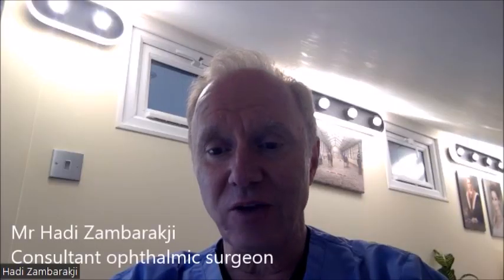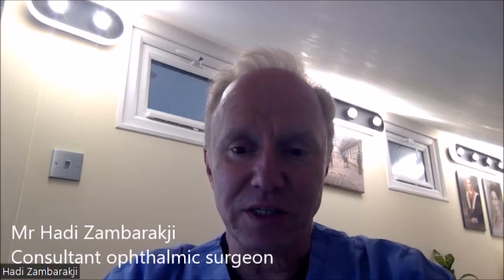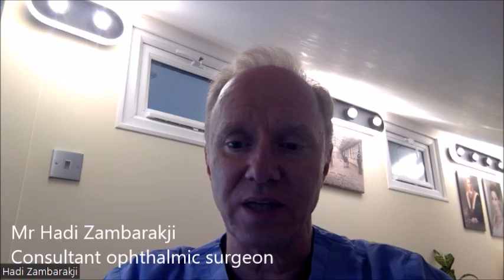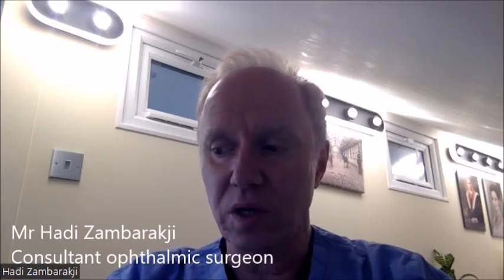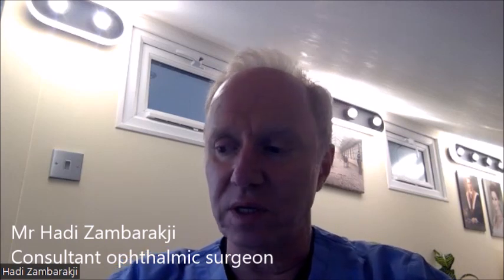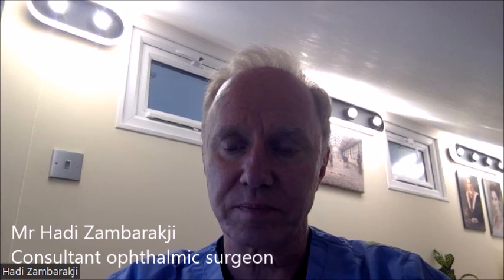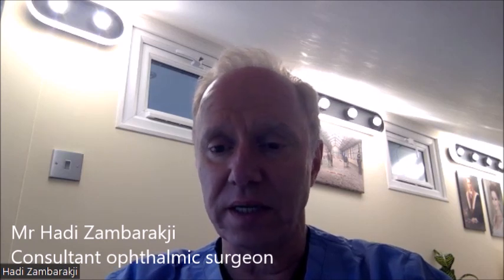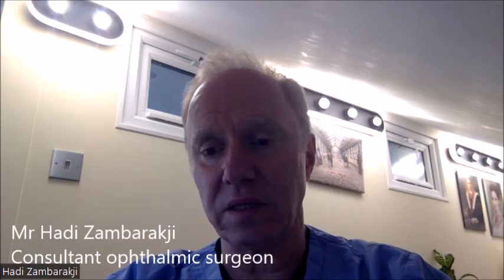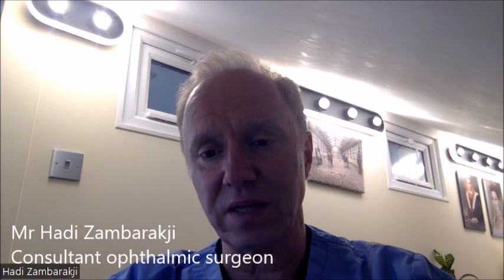I don't think I have a preferred lens implant. The right lens for one patient is not necessarily the right lens for another patient. So it's quite important, at the time of choosing the appropriate lens, to understand the patient's needs and requirements. You need to understand a number of things.